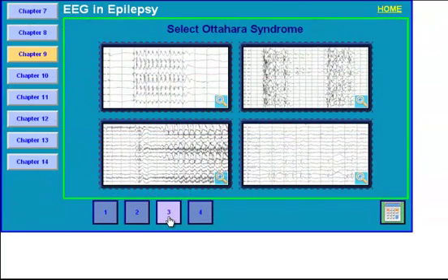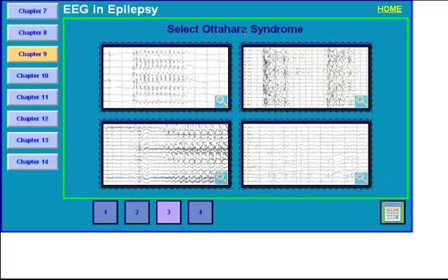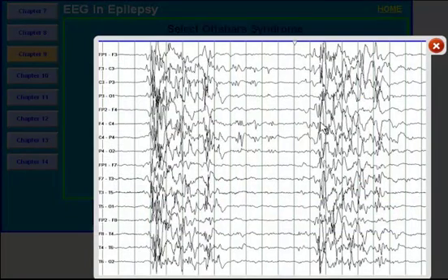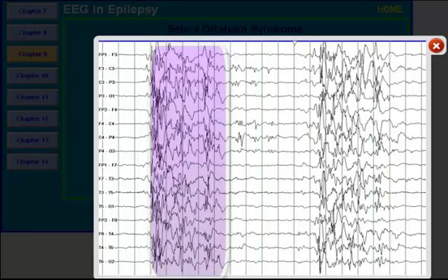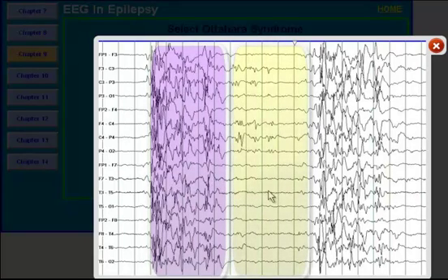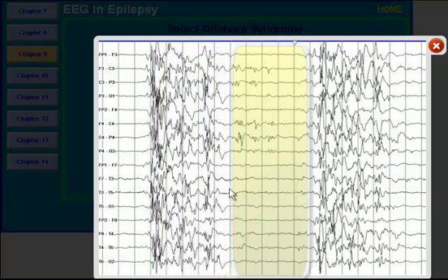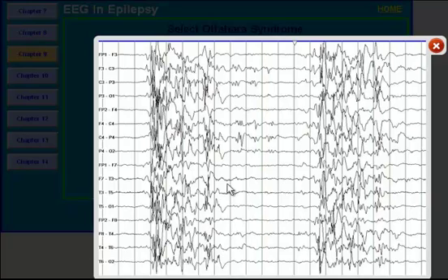So the third question, select Otahara syndrome. Otahara syndrome is an epileptic encephalopathy. One of the hallmarks of the EEG is this burst suppression pattern. Here you see a burst which lasts for approximately 4 seconds, followed by a period of suppression that is 3, 4, 5 seconds. If you see burst suppression pattern, you can see it in epileptic encephalopathy such as Otahara syndrome, but you can also see burst suppression pattern in any age group if someone has suffered a severe anoxic brain injury. Burst suppression pattern can also be chemically induced by propofol, pentobarbital, and several anesthetic drugs.